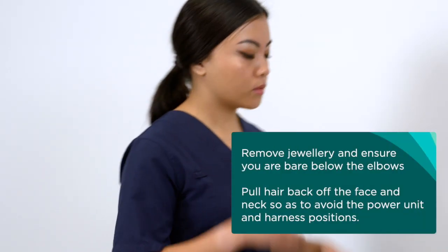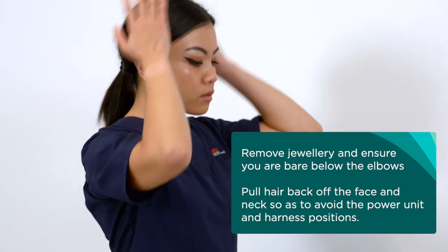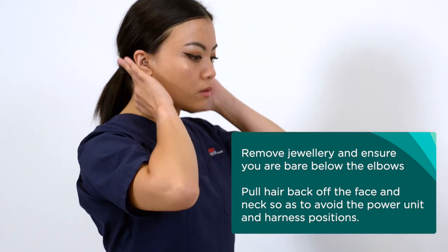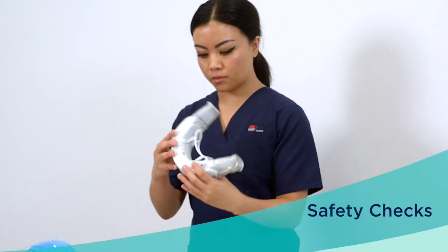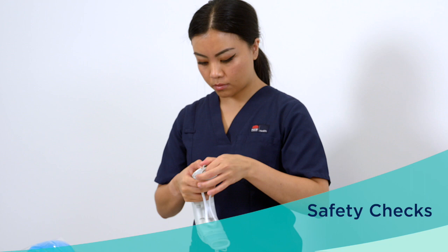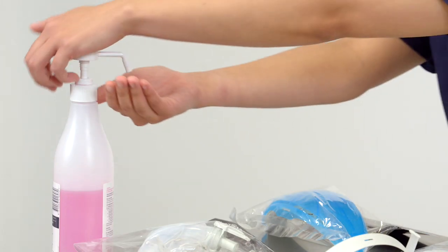Remove any jewellery and ensure you are bare below the elbows. Pull your hair back off the face and neck so as to avoid the power unit and harness positions. Before using the CleanSpace Halo, you will need to perform some safety checks on the power unit. First, perform hand hygiene.